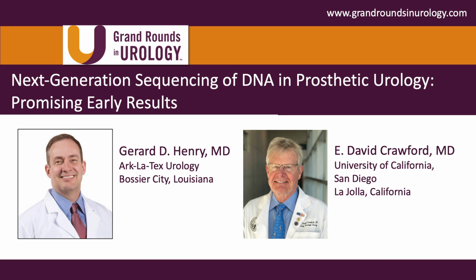It would definitely give you a quick, rapid response. That's the idea behind it. I would almost compare it to a gram stain in terms of how quick you can get the data back, and it can show you the major pathogens within 2 hours. So it's the more common pathogens, 25 to 30 or something like that, correct? Yes, sir. That's the way it works.